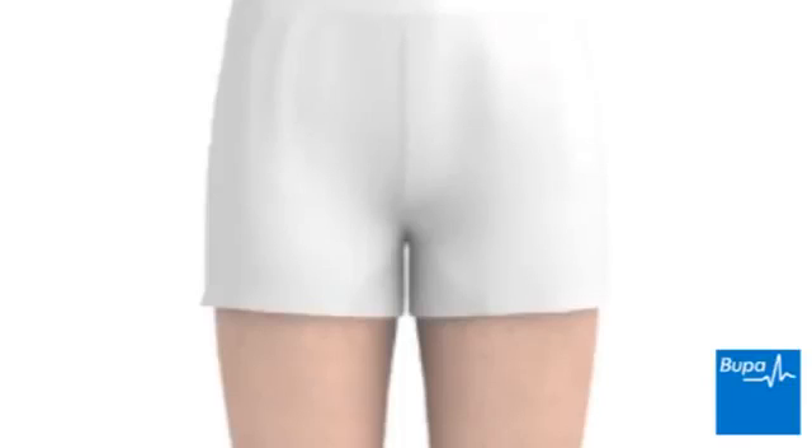This animation will show how a diseased or damaged hip can be treated with the hip resurfacing procedure. Click the navigation arrows below the animation screen to play, pause, rewind or fast-forward the animation.